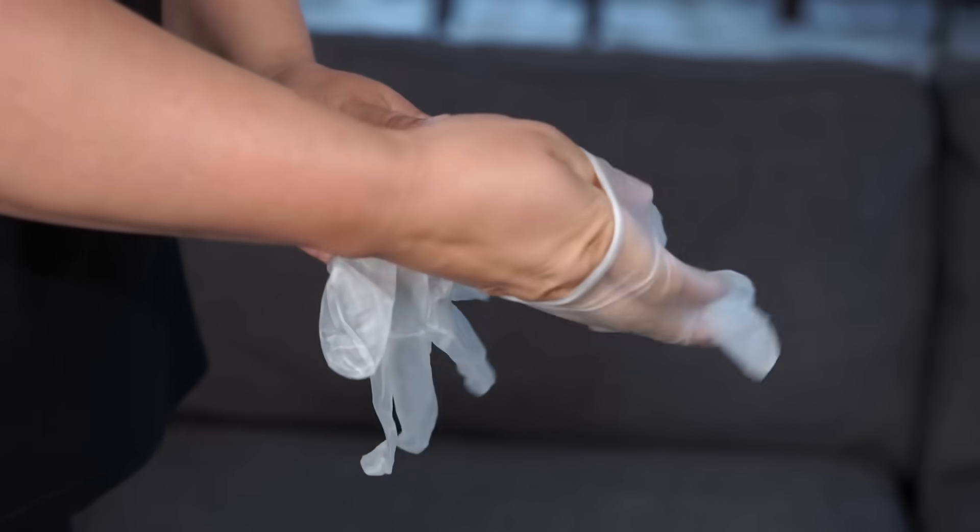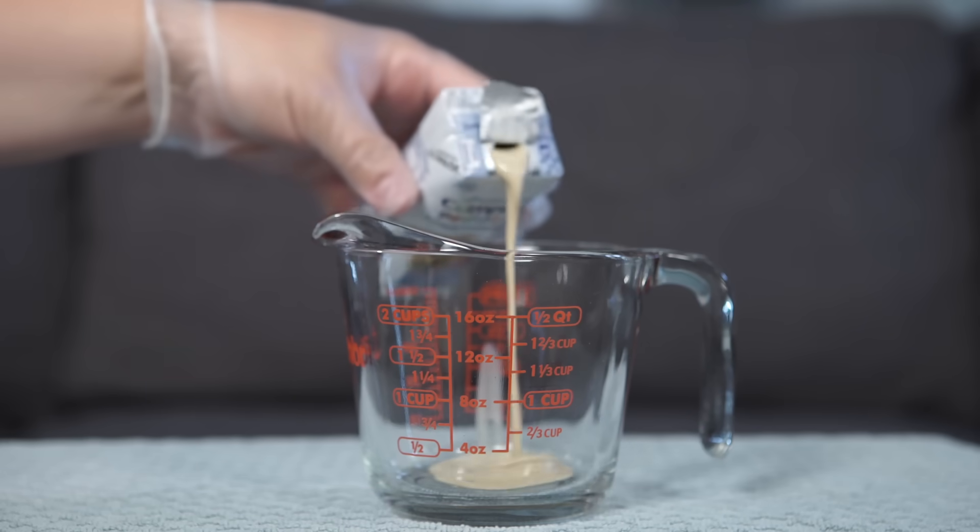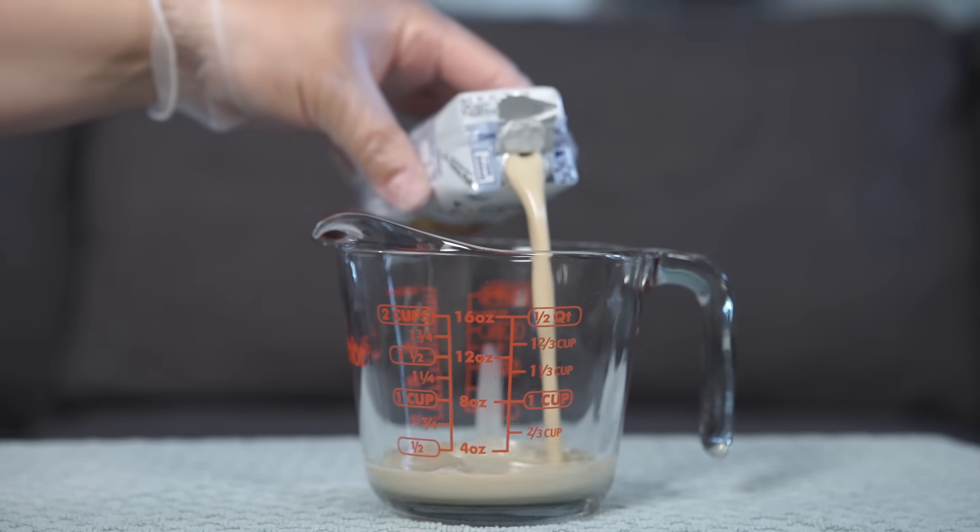Put on the non-sterile gloves. Measure the prescribed amount of formula for one feeding into a clean container.